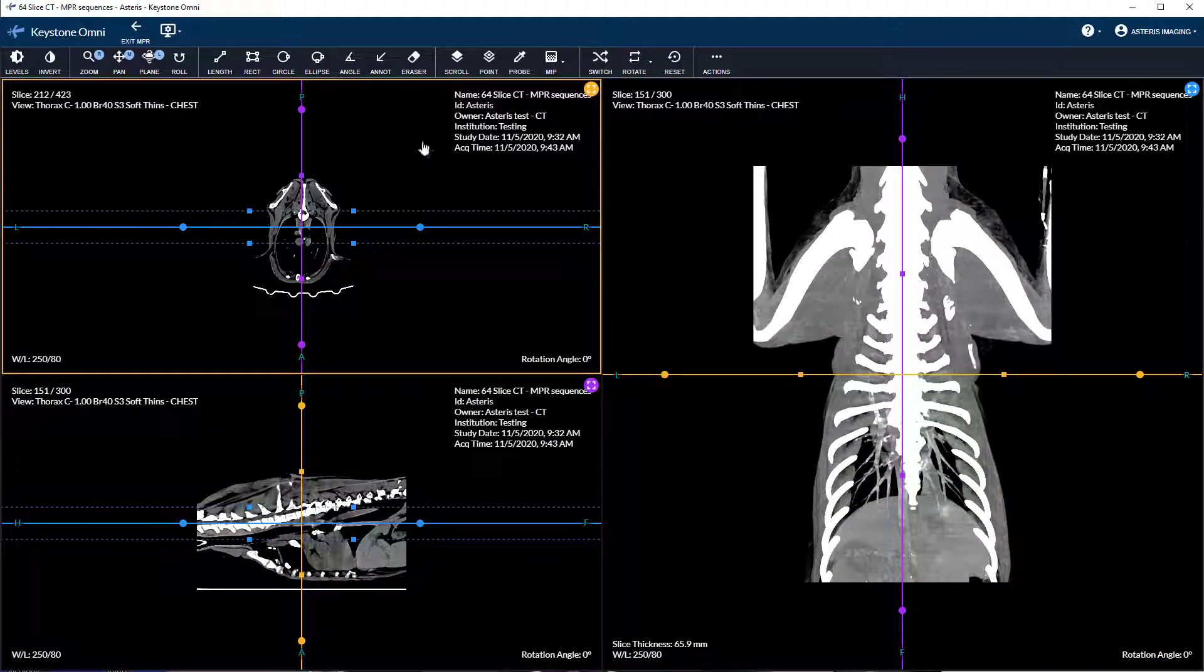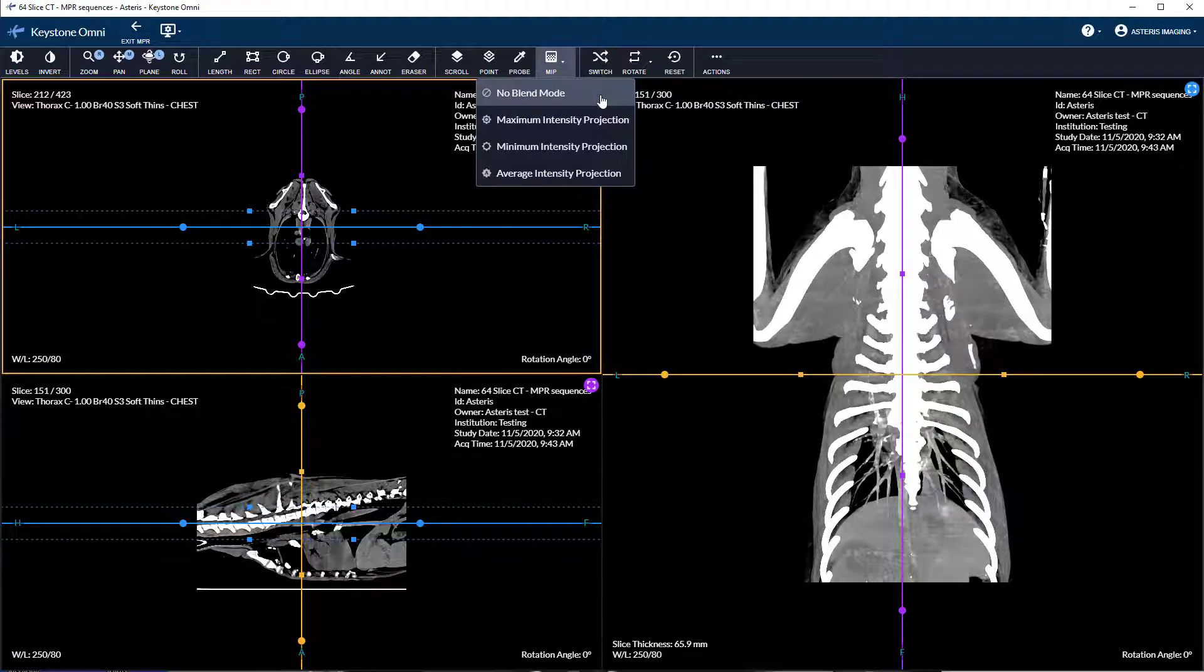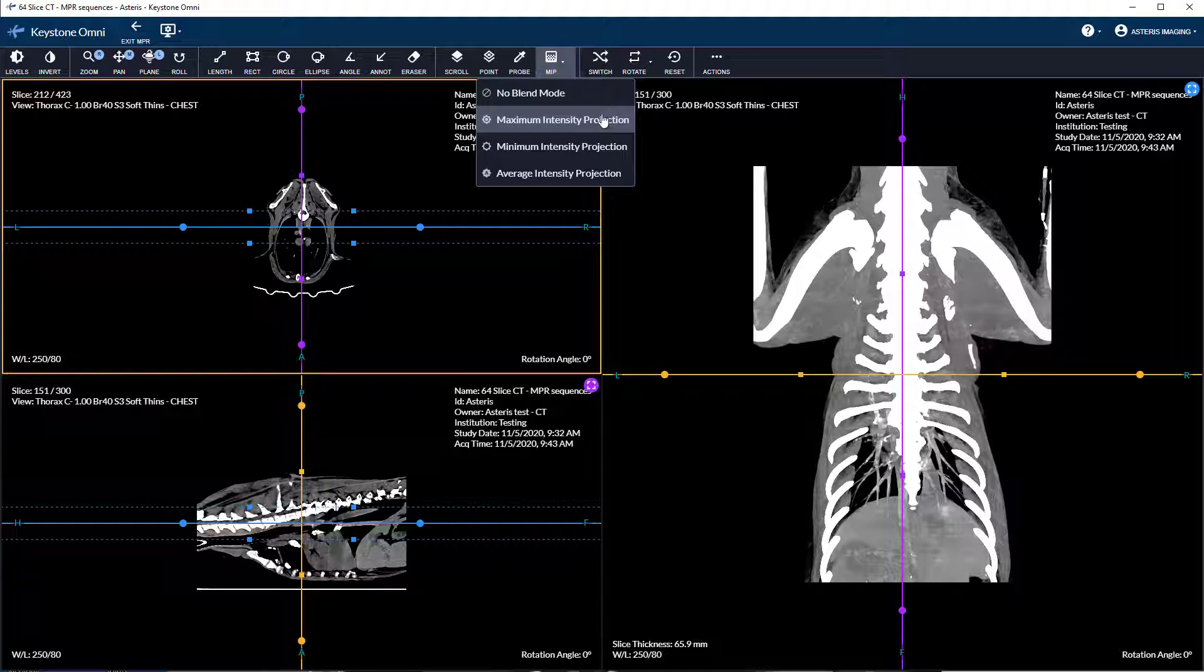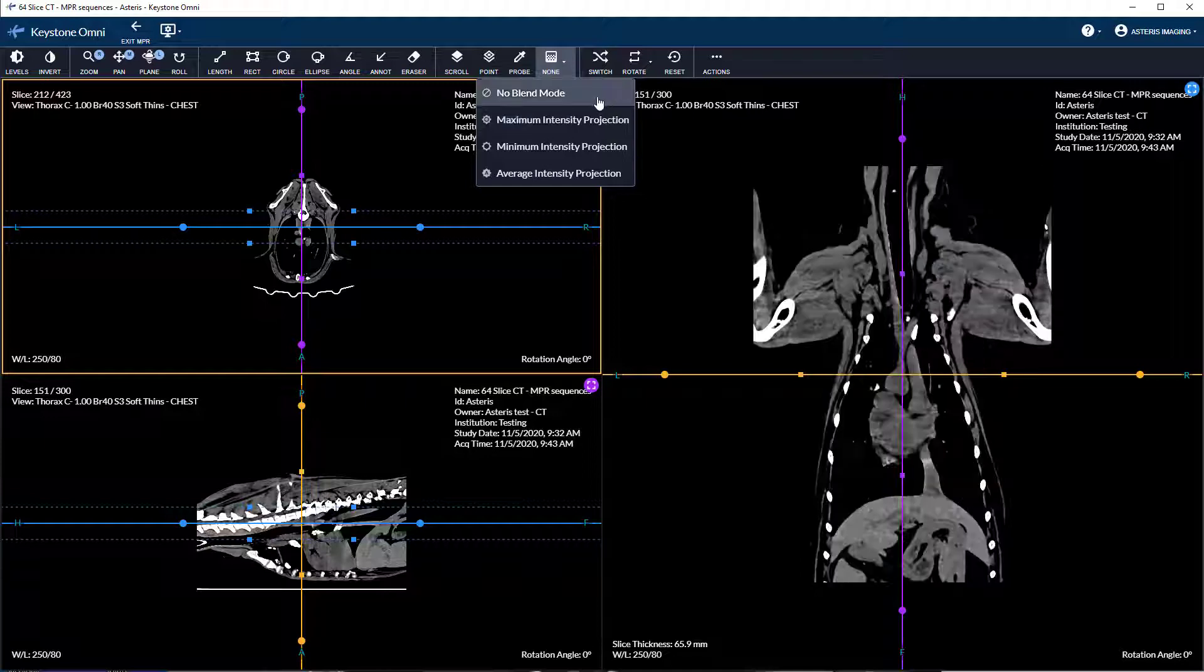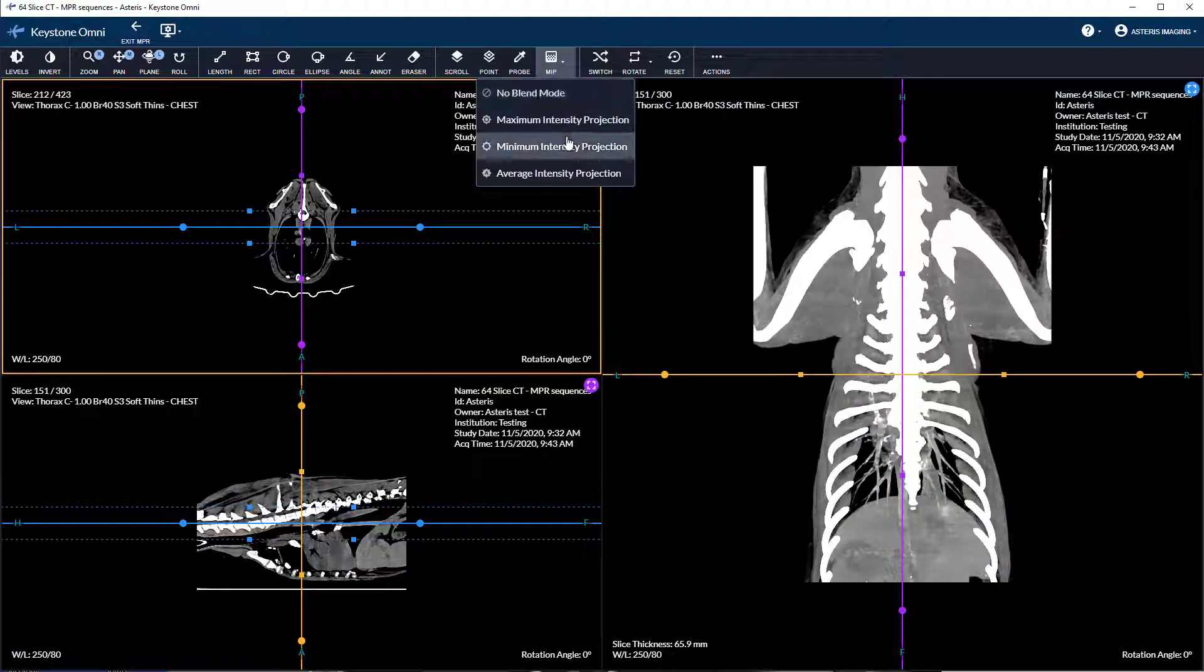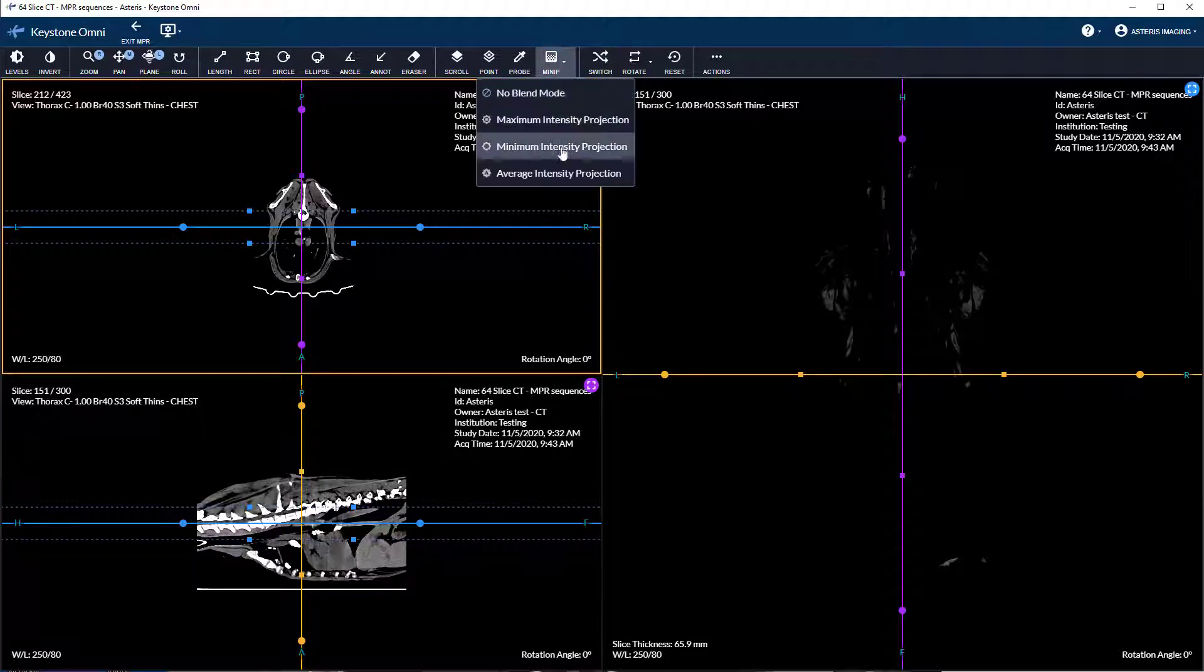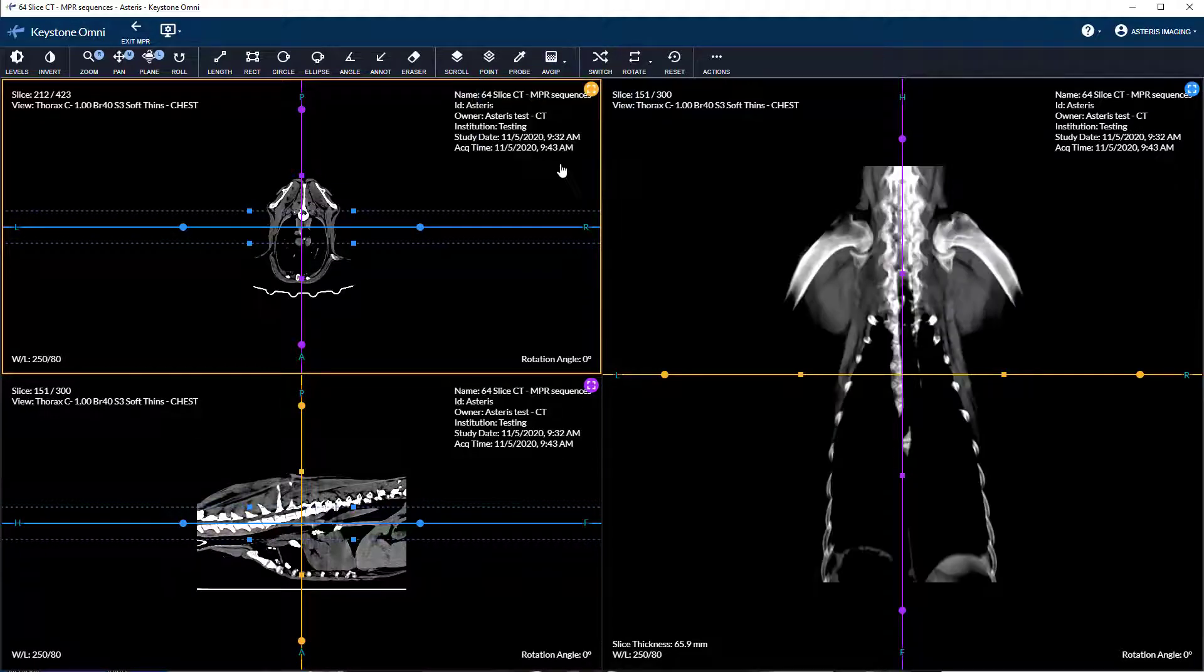Intensity projection provides interpolation of slice thickness. The default setting is maximum intensity projection. There are four modes available: no blend, maximum intensity projection, minimum intensity projection, and average intensity projection.